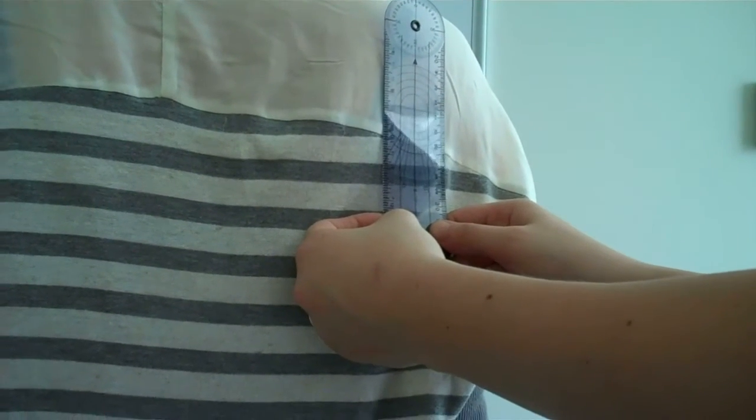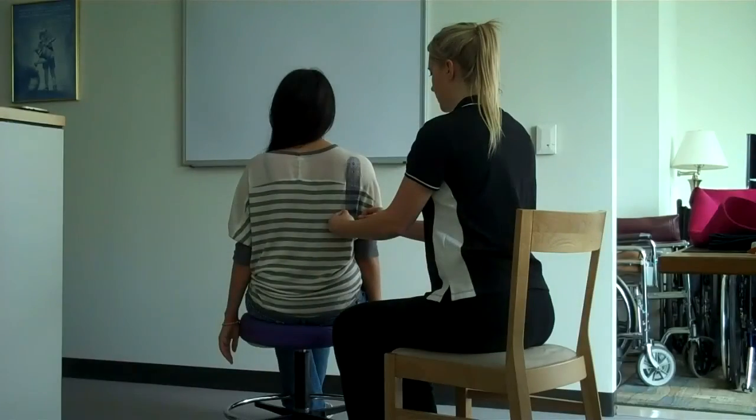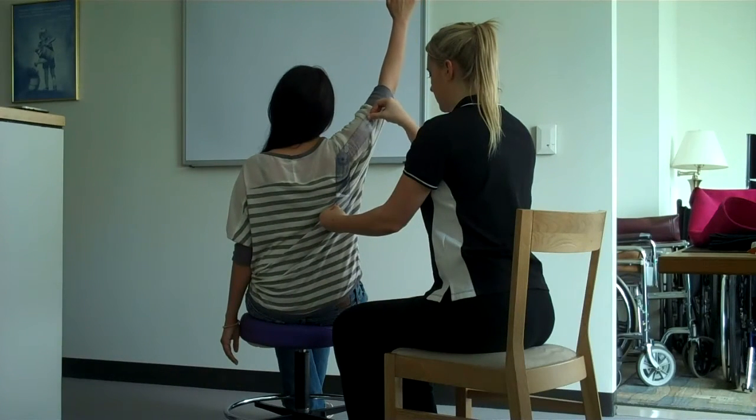The stationary bar is parallel to the trunk and the movable bar is parallel to the humerus. The client's arm is raised to the side of the body in a frontal plane of movement. The measurement begins at 0 degrees and ranges to 170 degrees.